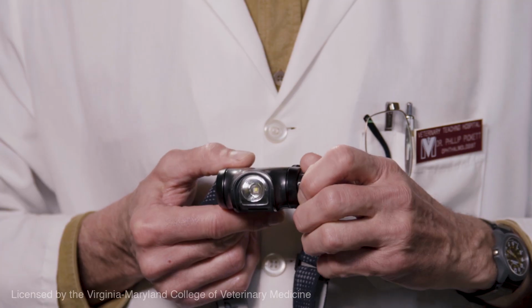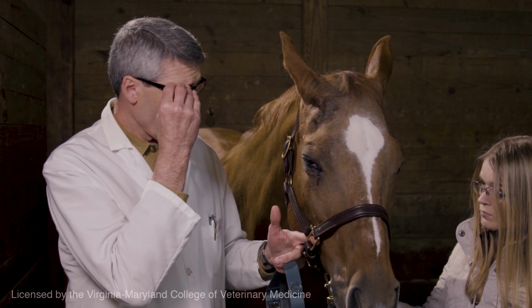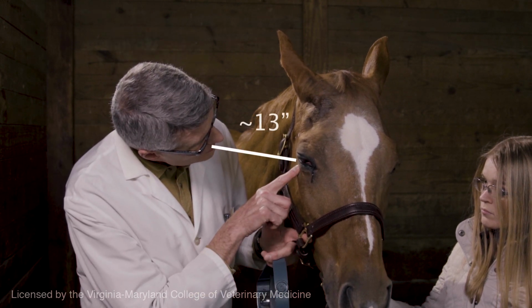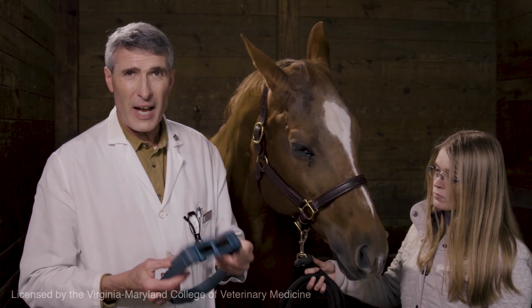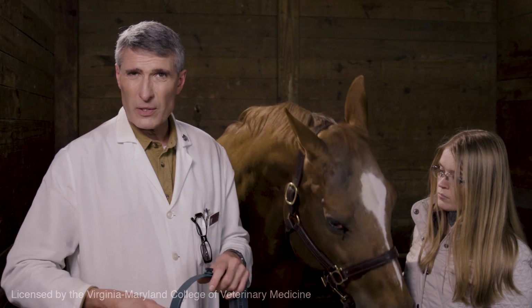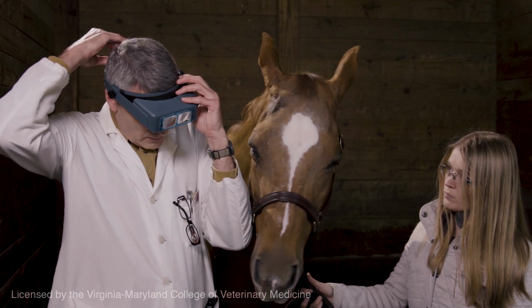So first, for magnification, everyone is familiar with reader glasses. This 3-diopter lens will allow you to get 1/3 of a meter from the surface of the animal, so that's about 13 inches. Likewise, some people use these optivisors, and basically this is a 5-diopter optivisor here, which allows me to focus at a fifth of a meter, which is 8 inches.